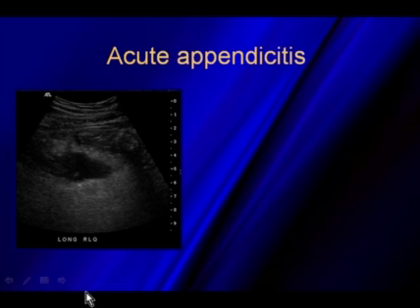This is a patient that, as we call, has on their winter coat. You can see even before we get to the area of the inflammation, we're already at about 3 to 4 centimeters in depth. A key to remember when you're using your high-frequency linear array transducer for any type of imaging: when you're trying to look at a structure deeper than 3 centimeters, you're starting to push that transducer too far. So when I started scanning this patient with a high-frequency linear array, I noticed this fuzziness deep in the image, and then, as I mentioned earlier, what I like to do when I switch to a lower frequency transducer is to go to a curved array because you get a wider field of view.